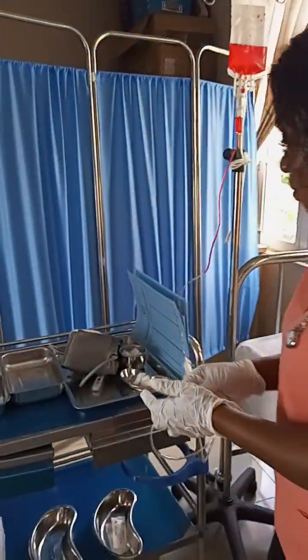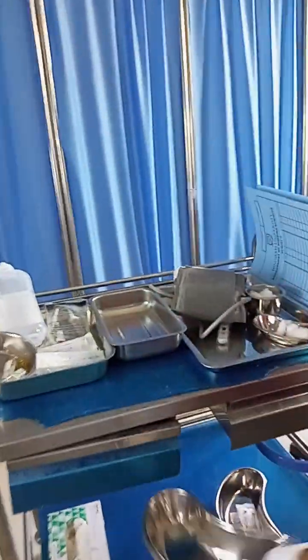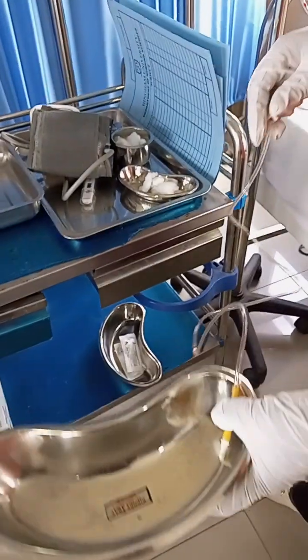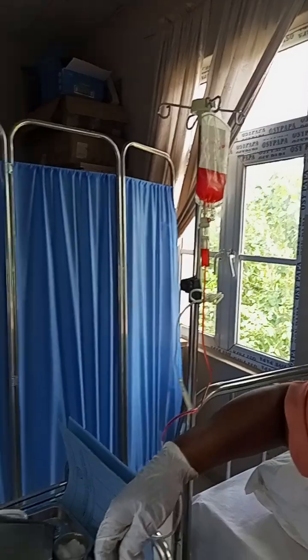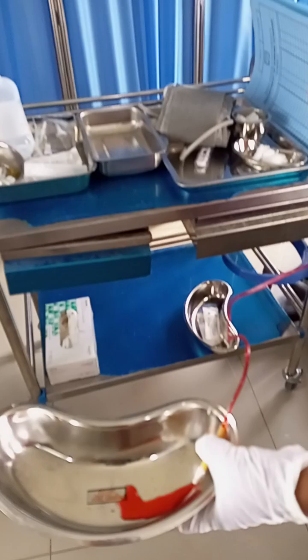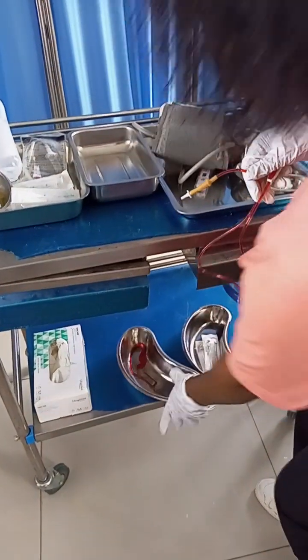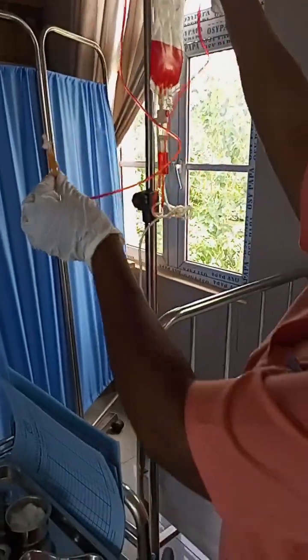So now the next thing is for you to expel air bubbles. You don't have to spill it on the ground. You can use a receiver or a gallipot. So you open the control valve and expel air. As you can see, now I don't have air bubbles in the tubing. I have expelled the air, so the blood is ready for transfusion.